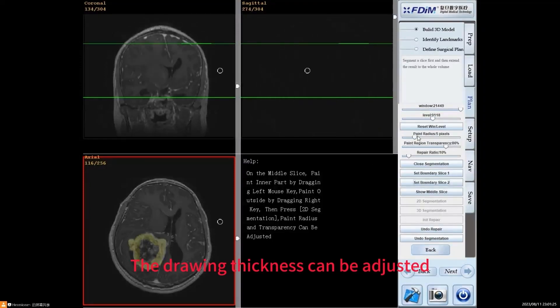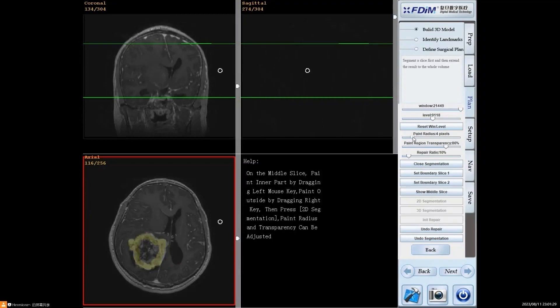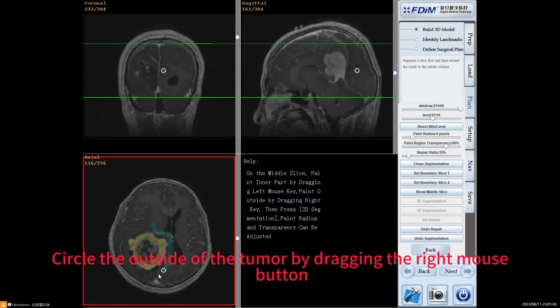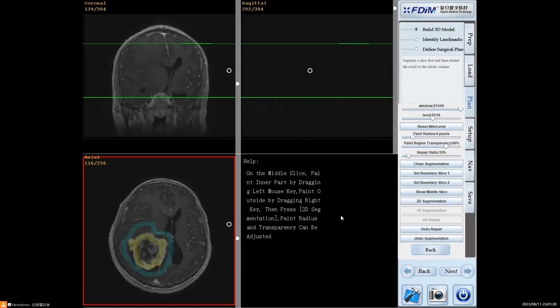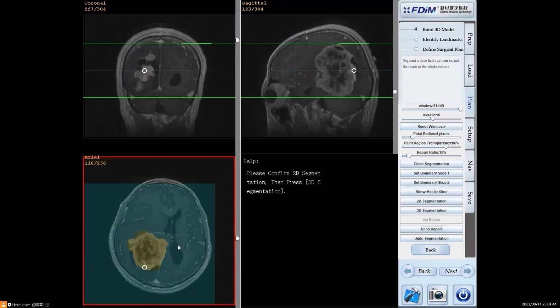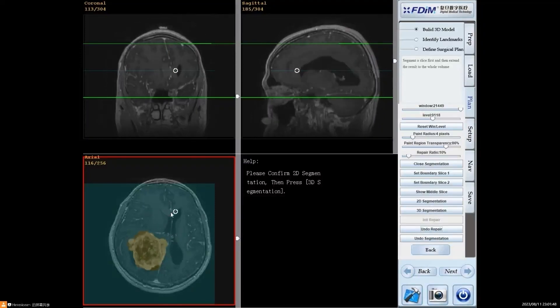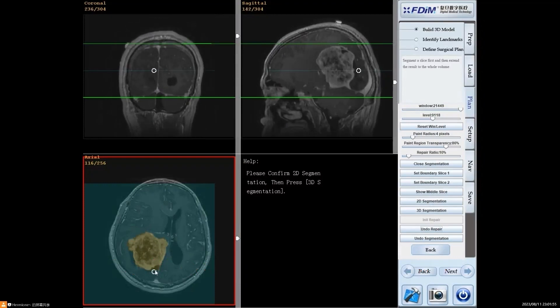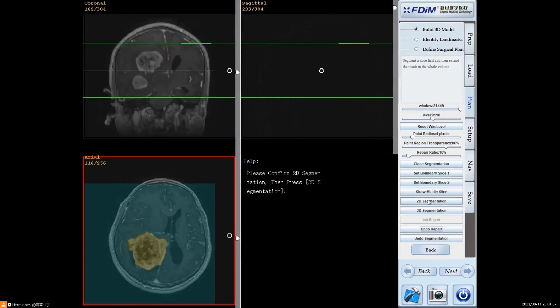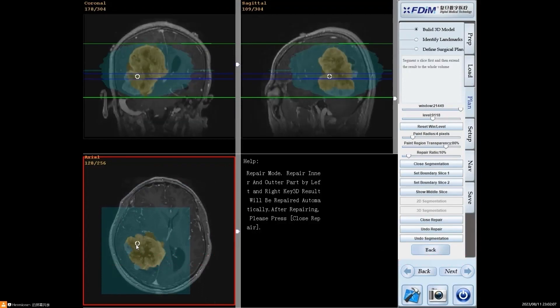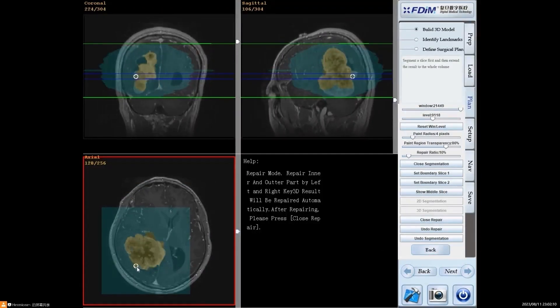The brush thickness can be adjusted. Circle the outside of the tumor by dragging the right mouse button. Two colors separate the tumor from the normal tissue. Repair the segmentation result by using the left or right mouse button.